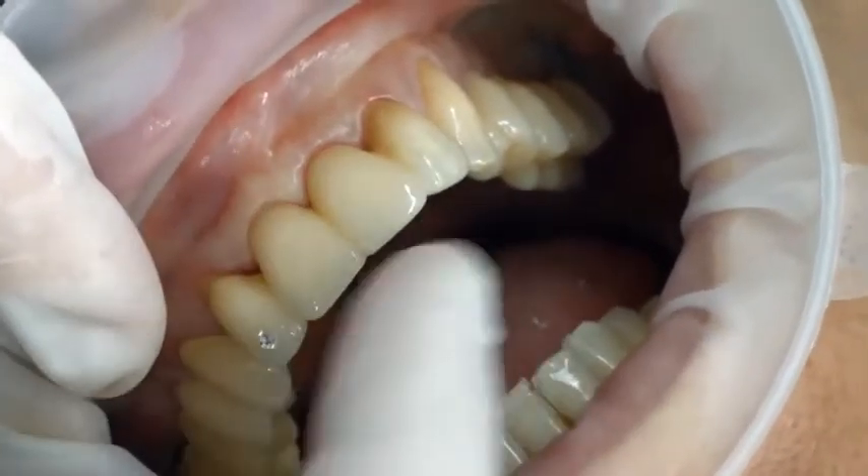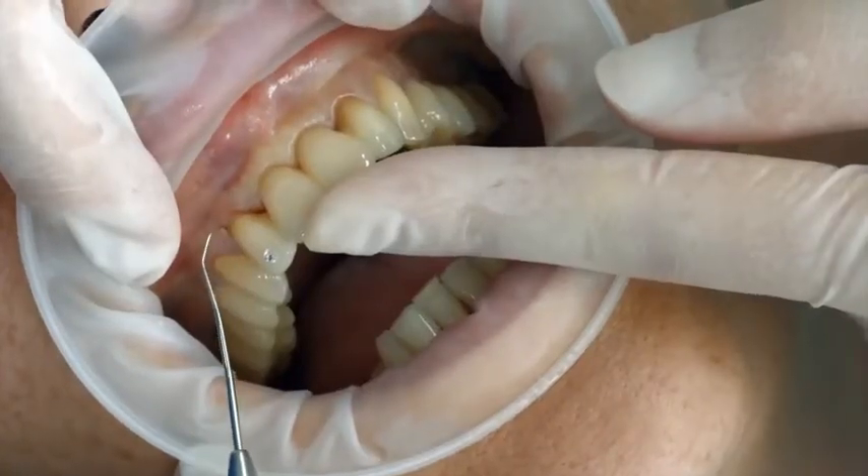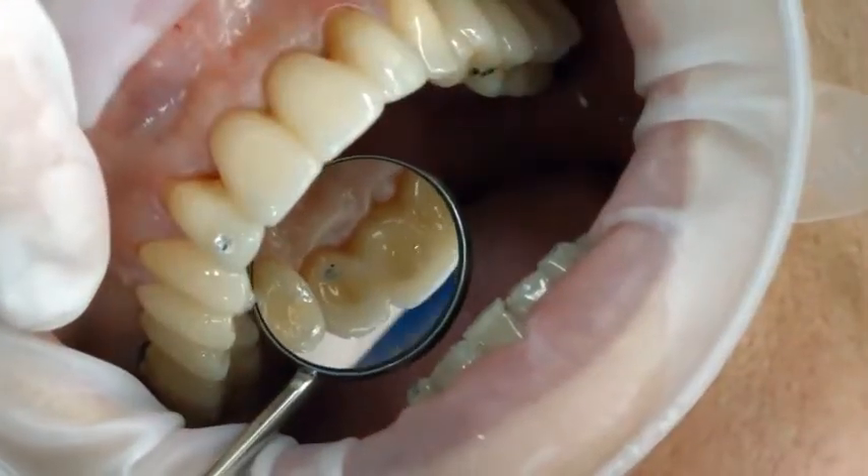When trying in the permanent restoration, check the accuracy of fit, shade effect, and occlusion of the restoration.